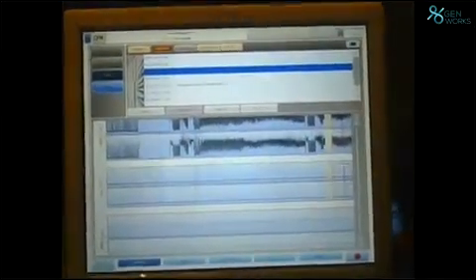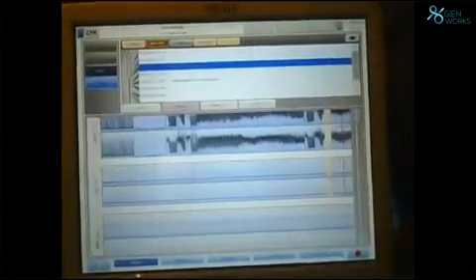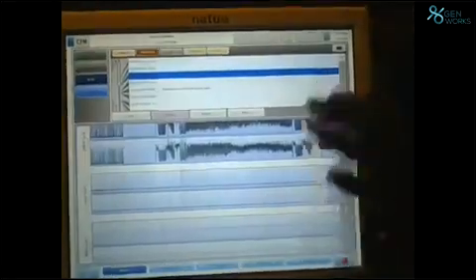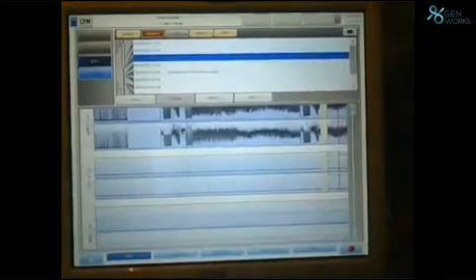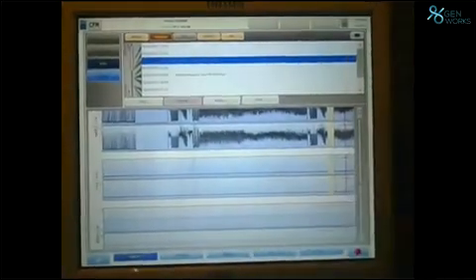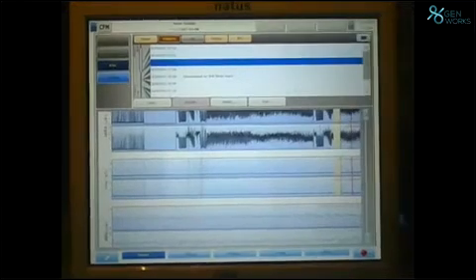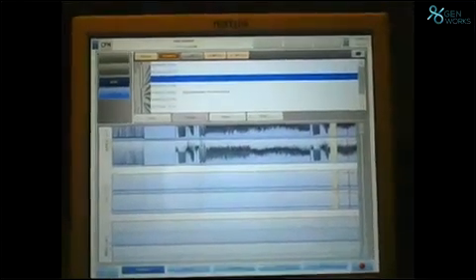This is one. Okay, sir, you told me the sister is writing, the doctor is writing, and the machine is also documenting, taking snapshots. Suppose I want the complete recording, that is also recorded in the machine. Go to the patient and record it, all the things, onto your pen drive. And wherever you need it, you take a snapshot. That option is also there.